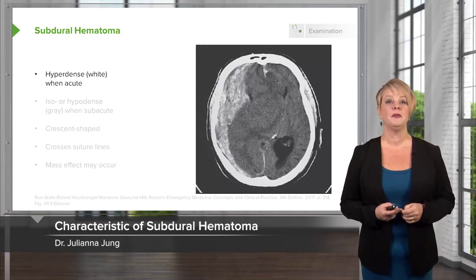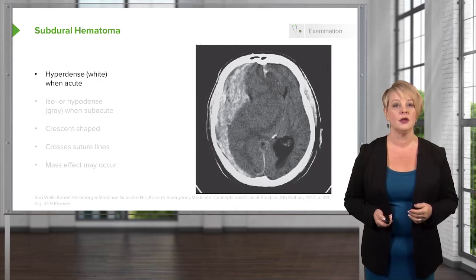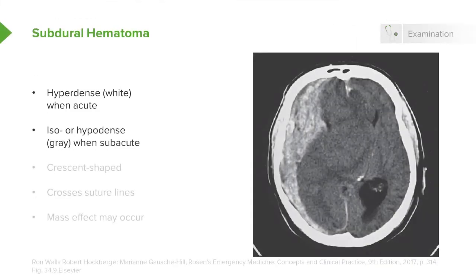Let's move on to subdural hematoma. Subdurals also appear hyperdense or white when they're acute, but they can become isodense or gray when they're more subacute, as subdurals accumulate more gradually over time. In many cases, if they're chronic, they can be hard to see because they're basically the same density as the brain. Unlike epidurals, subdurals are crescent-shaped — convex on one side and concave on the other, sort of like a crescent moon. Subdurals will cross the suture lines because they're inside the dura, and the blood can intercalate all around the brain.